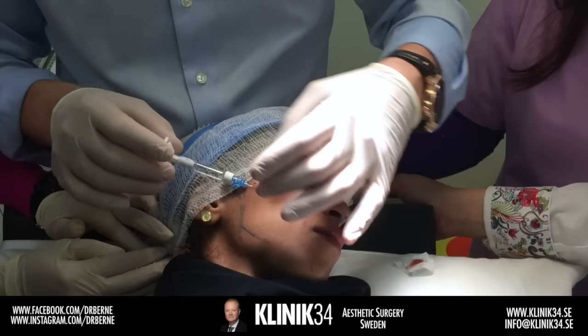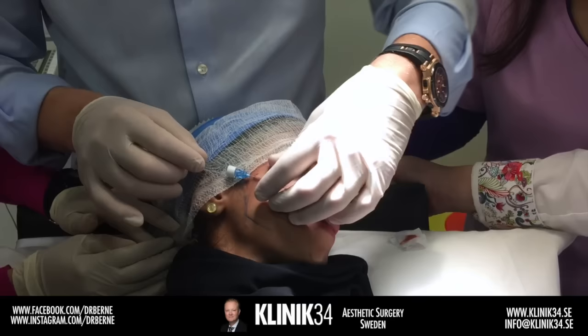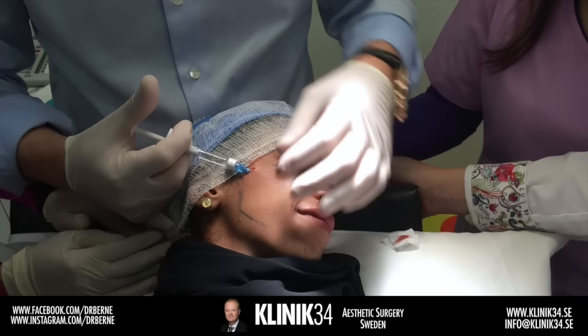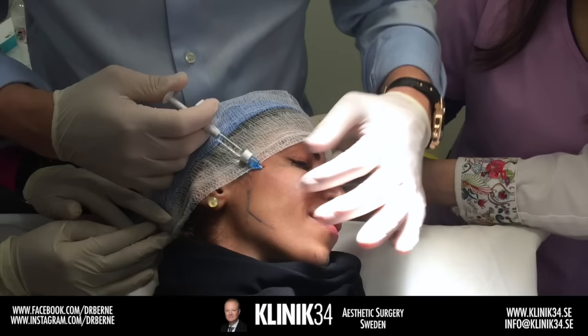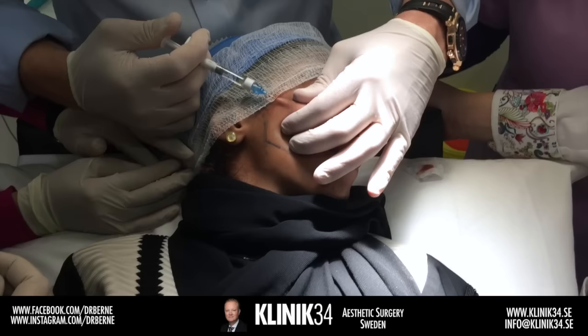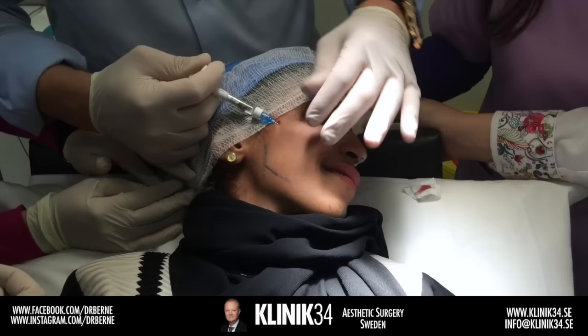Once I've reached it — you can see it moves freely with no resistance. When she smiles, the smile will move freely and will not look strange or artificial. If we do a more superficial injection it will move with the filler. The point is to go deeper — it's a natural space, so we will not have migration.